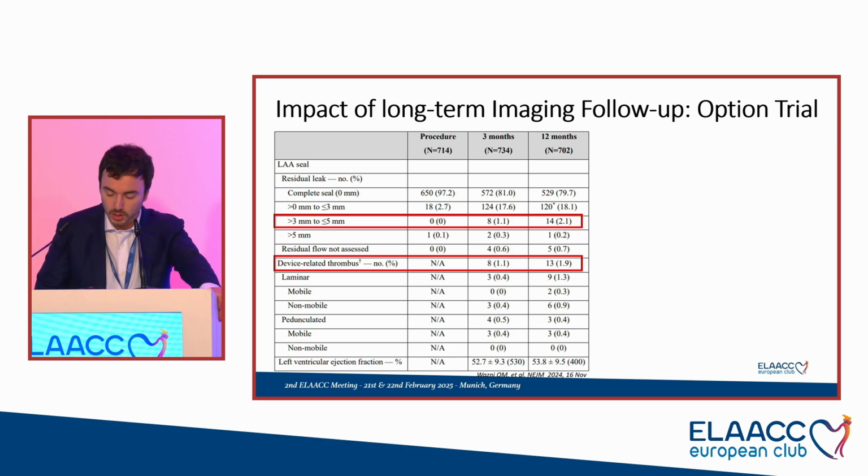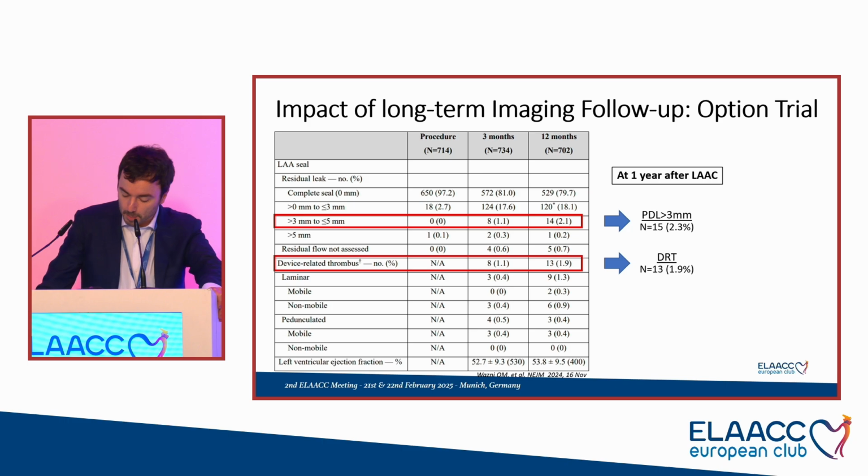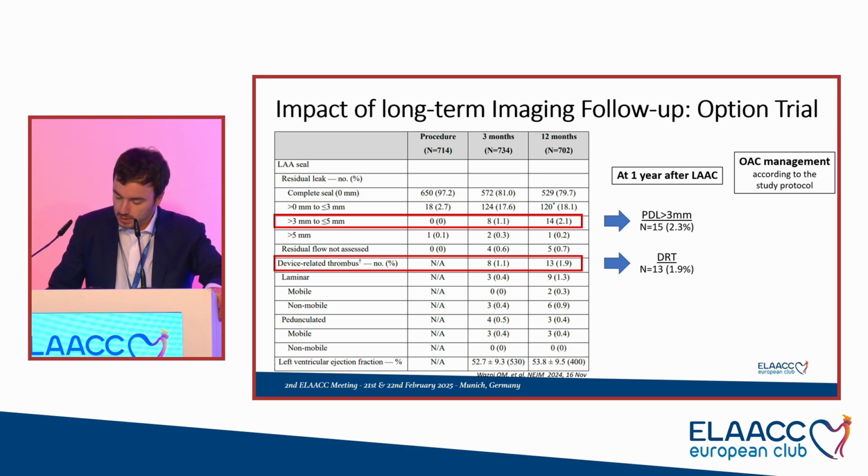For the OPTION trial, that is a contemporary trial, we observed at 1 year a PDL more than 3 millimeter in 2.3% of cases, and a DRT rate of 1.9% of cases.